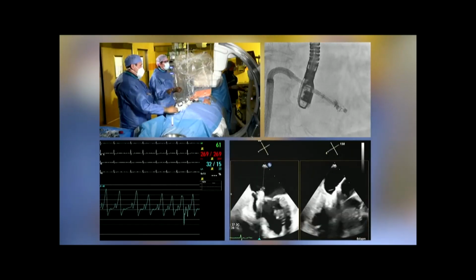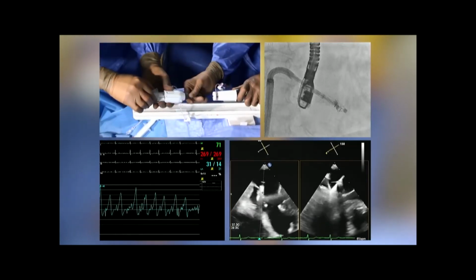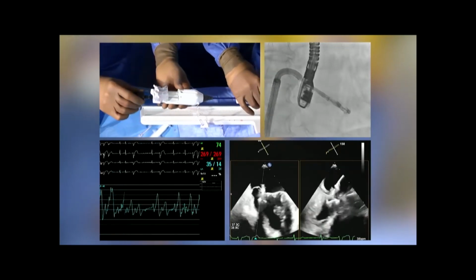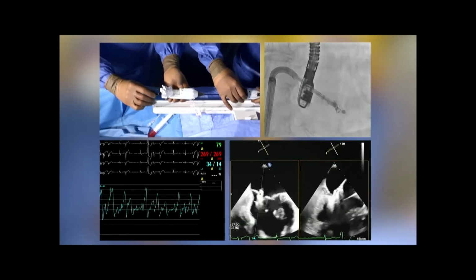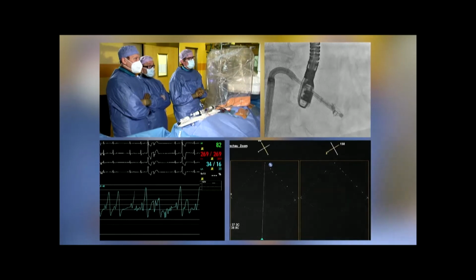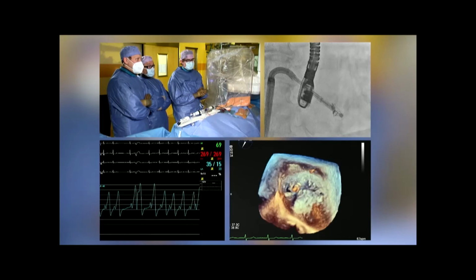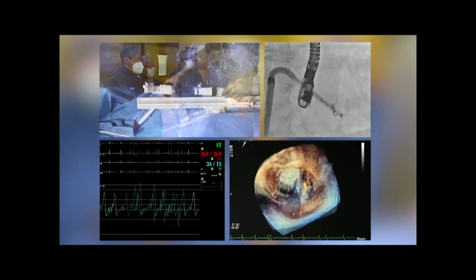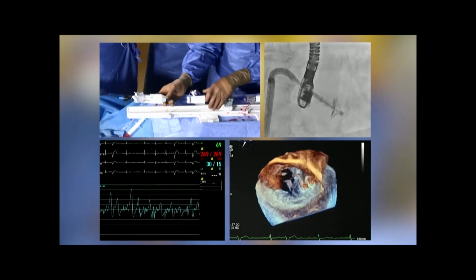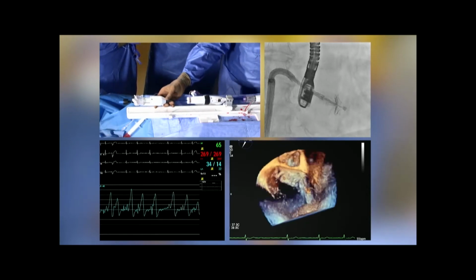We will do the clocking in a second, but I'd also like to come more medial. Okay, let's bring up the clasps. Okay, so I'll try to be more medial now. 3D, please. We change the clocking. That will change the medial lateral position as well. And maybe we can even come a little bit more medial, huh? Yes, and then more medial if possible, but that's not easy. There is already a bit of tension on it.